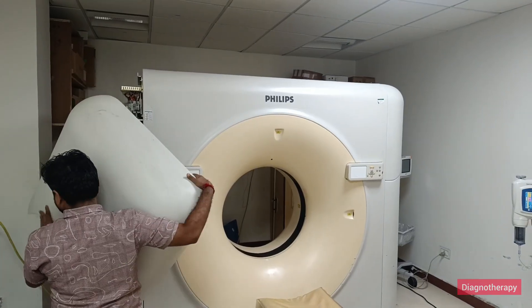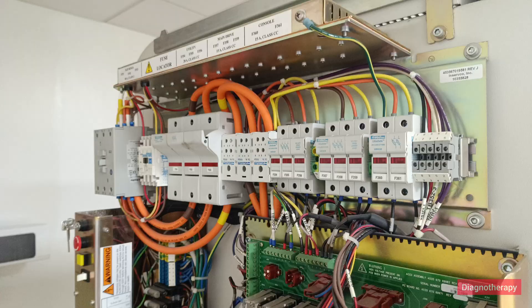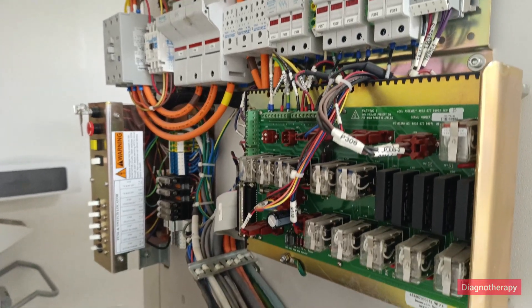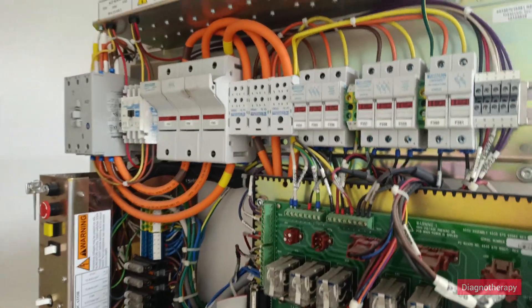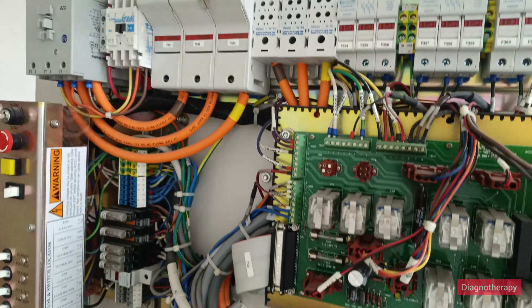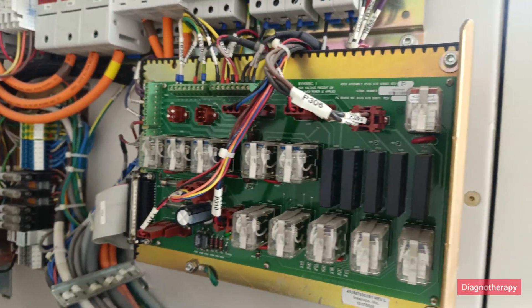Firstly, we will be removing the panel. This panel consists of all the power cords, power cables, and power distribution system. This setup is mainly responsible for the power distribution and power management. If there is a breakdown, we first check all the wires and PCBs.